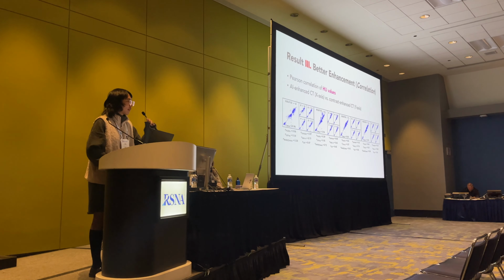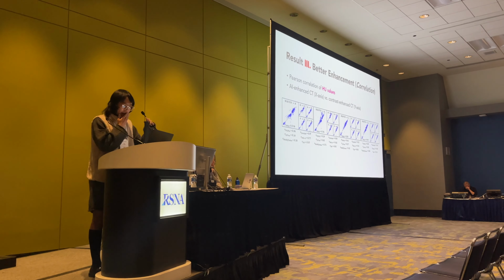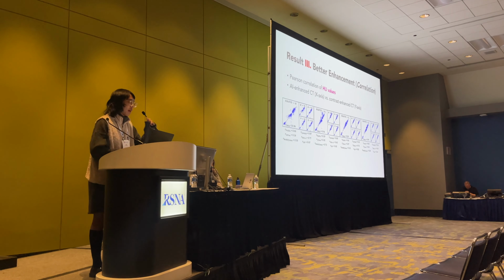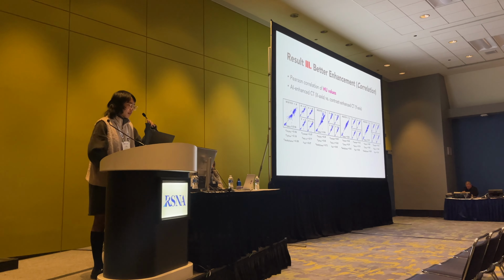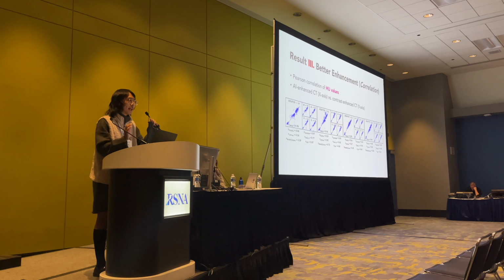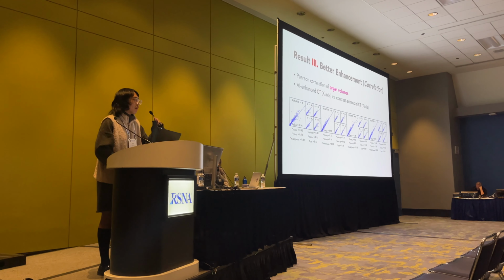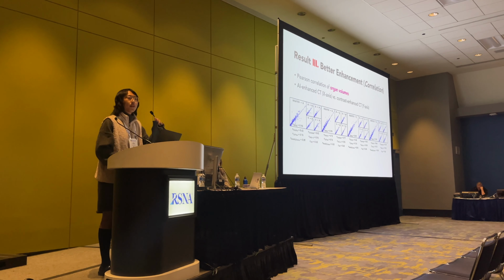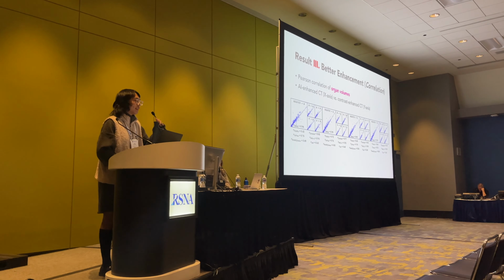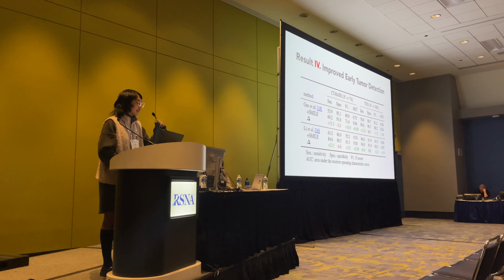Following that, we also did a correlation analysis to show that we are doing the right enhancements, which means that we enhance every organ in a correct way. Here we introduced the Pearson correlation of attenuation values across all the tests, not only from non-contrast to contrast, but from all directions to another. We did the best of all. And here is the organ volume correlation, just to prove that all the organs are well preserved, and we did a good job.